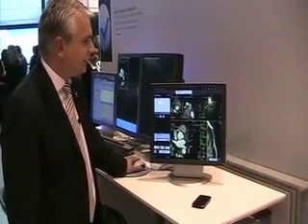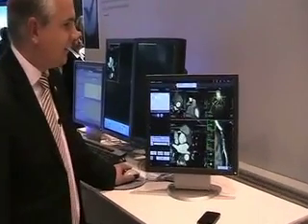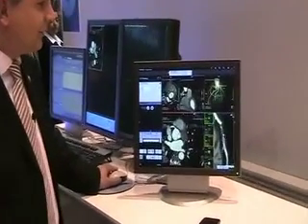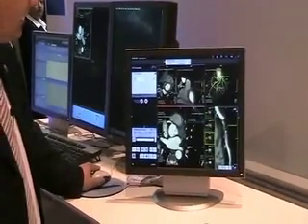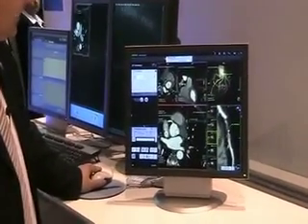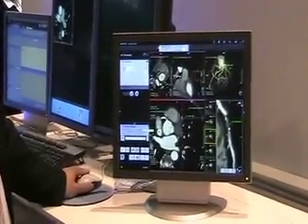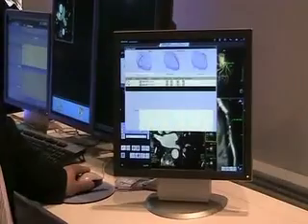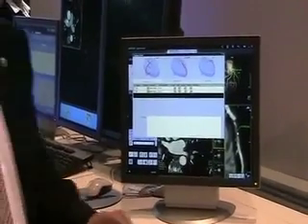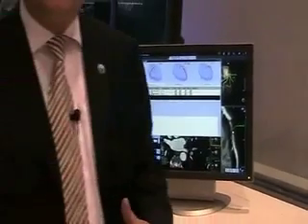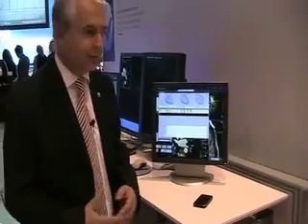You have 100% occlusion in this patient and once you're finished with the reading you create a finding in the findings navigator and basically create a structured report that you can export to the RIS system through HL7 format.